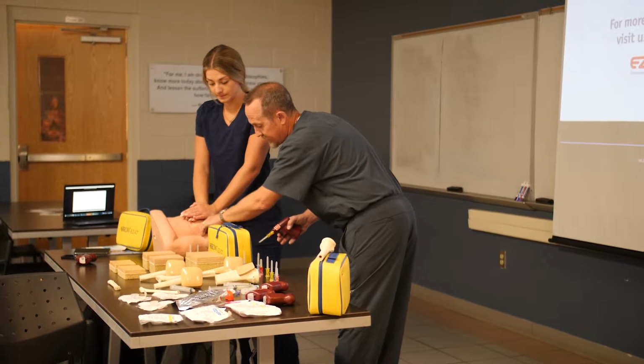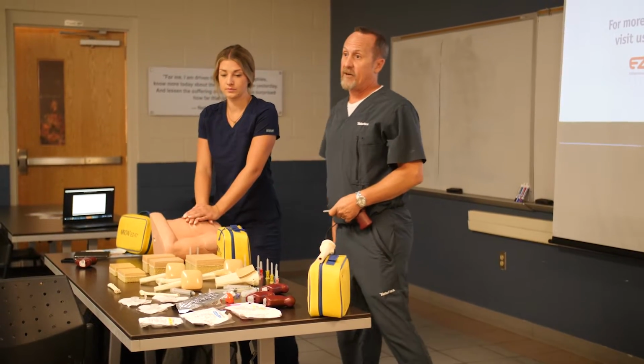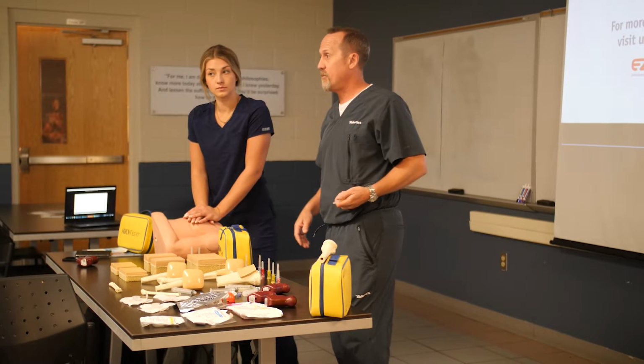I can come in and actually identify my target area, place it, put a dressing on, flush it, and have it going in 10 seconds and be out of the way. So very, very achievable, even with all that activity at the head of the bed. Does that make sense to everybody?